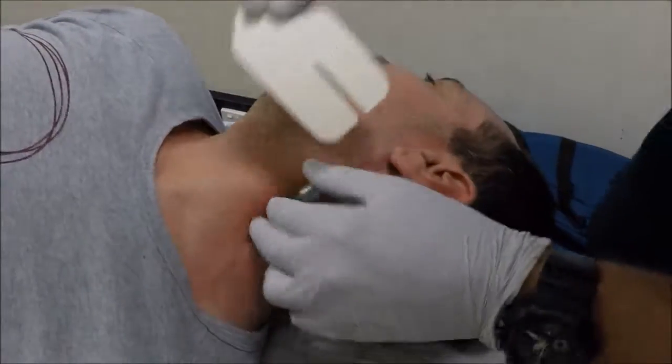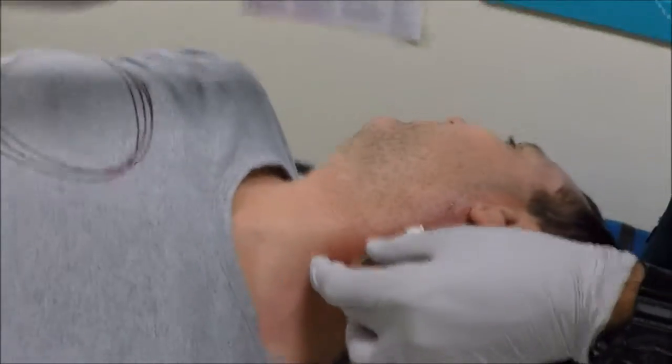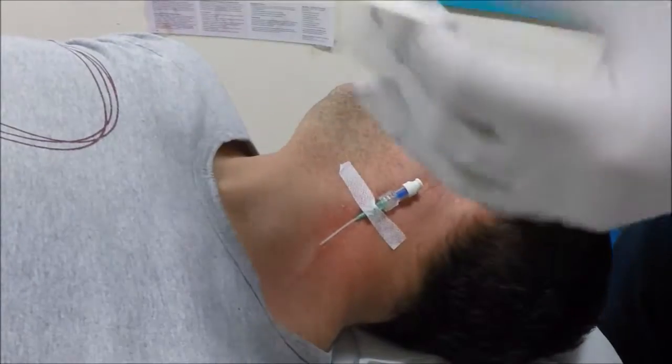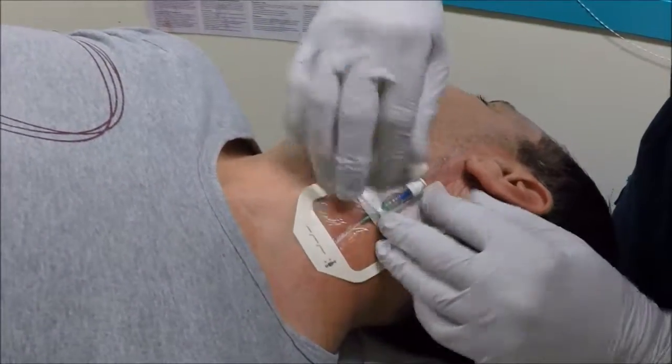Once we've ensured patency, with my Op-Site we'd secure the EJ cannula in situ, ensuring that we've got no extravasation, no hematomas outside the cannula.